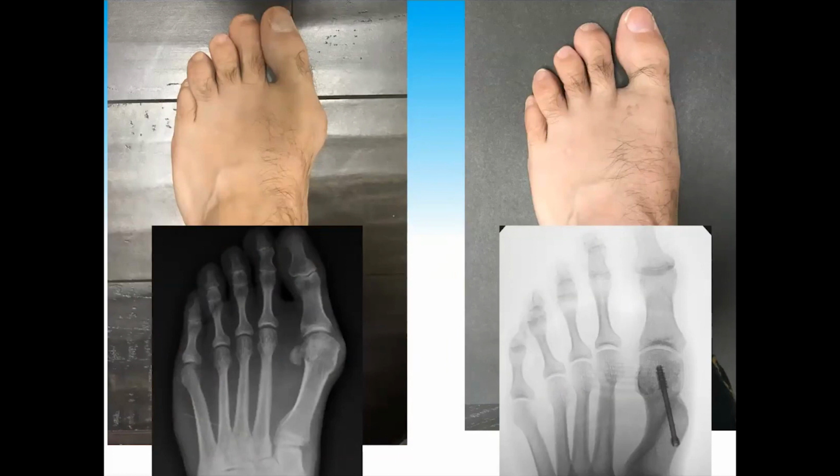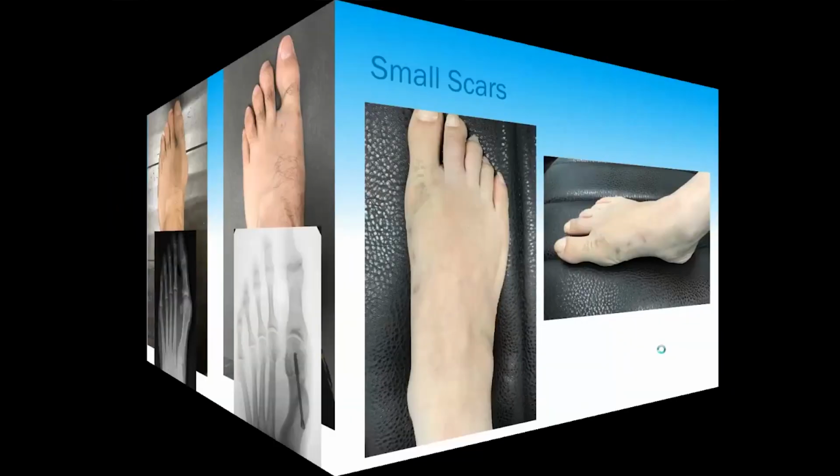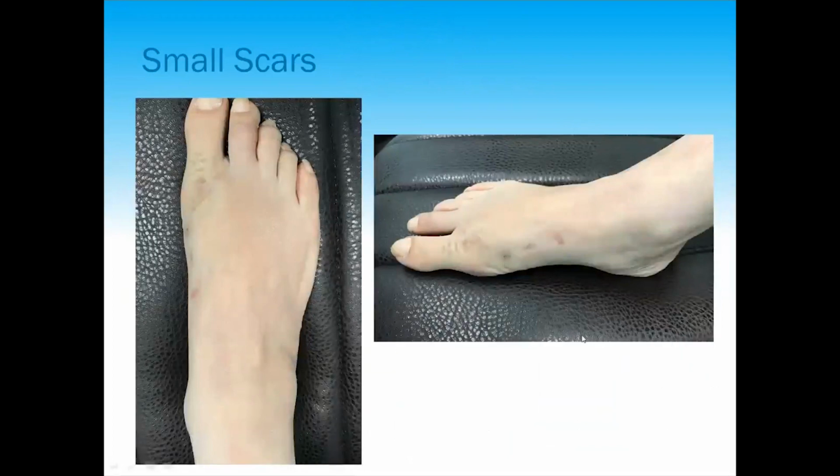So that really helped with correction. Also doing some soft tissue rebalancing through a percutaneous incision was done. So this modified technique basically allowed for internal fixation, which is more rigid fixation, and also some soft tissue balancing procedures with a few small incisions medially.